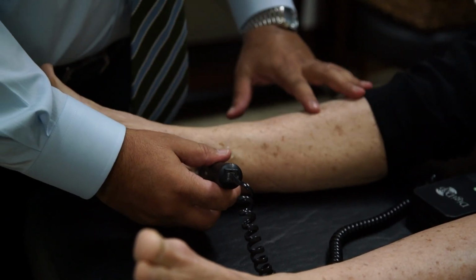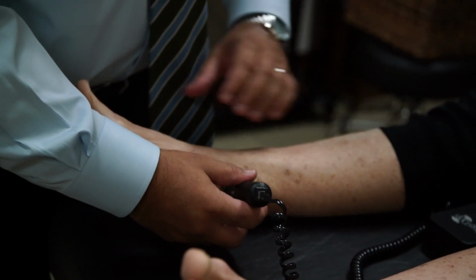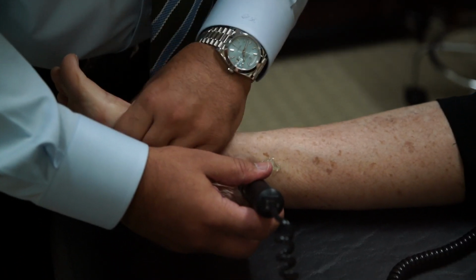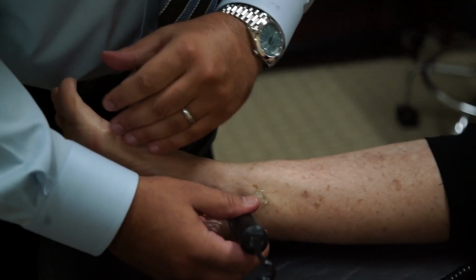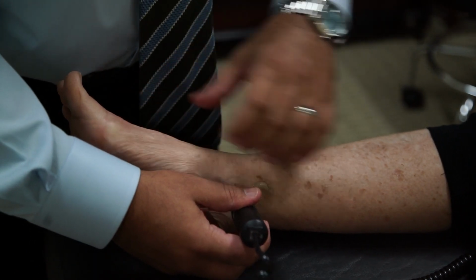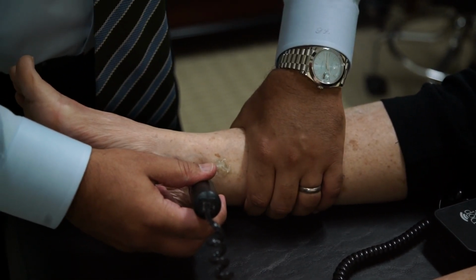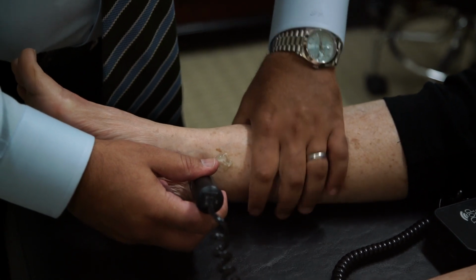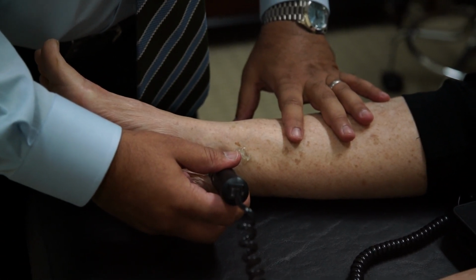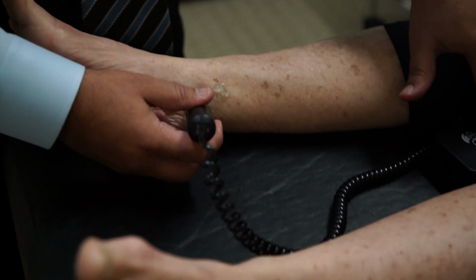So this is your, do you hear that? Well, I hear it. What is it saying to you? Okay, so when we squeeze your foot this way, we should hear a swish. You hear that swish? That's your blood being pushed down your artery, your veins, okay? Your vasculature. Now if we push here, we shouldn't hear anything. How come? Because your valves are really weak. My bowels? Your valves. Your venous valves. That's probably why your leg's getting swollen. Okay? Check the other side here.